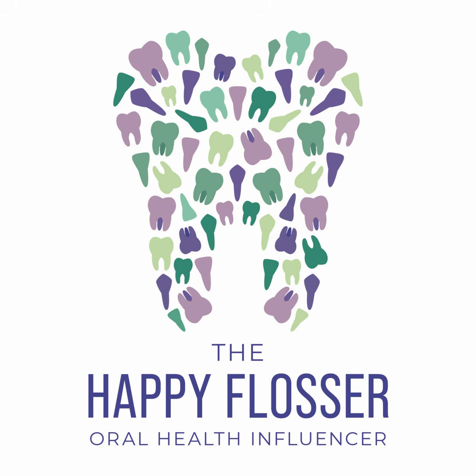Always review the dental and medical history prior to taking any x-rays on your patient. You want to make sure that you're not overexposing or taking unnecessary x-rays on your patient. So it's important for you to find out if your patient has had recent x-rays at another office and what their history reveals about their x-rays or potential possible x-rays.